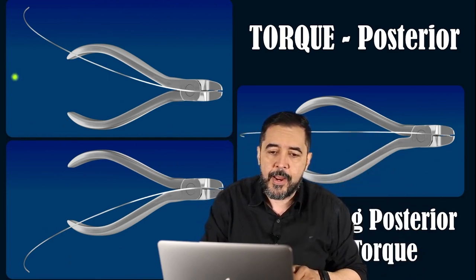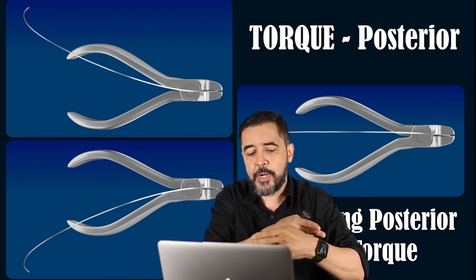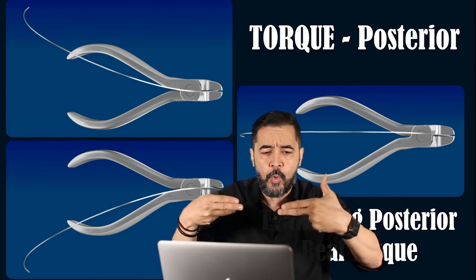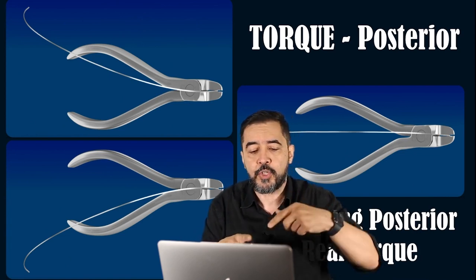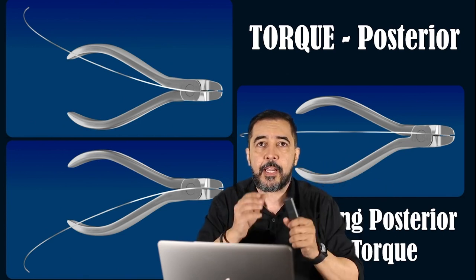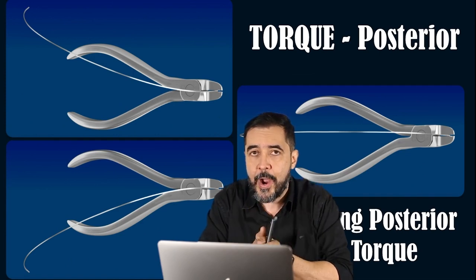So if I put my plier in a horizontal position related to the floor, and I grab here in the posterior part of the arch wire, the opposite tip of this wire goes up. And again, this is something related to the upper arch wire.